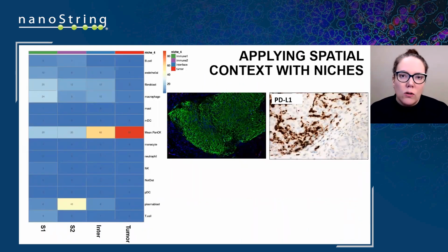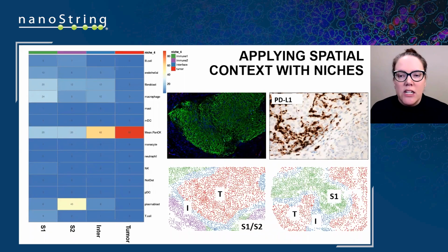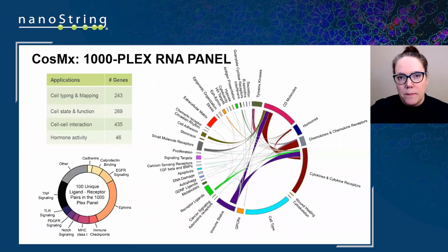So our next goal was to not leave it there, but to recognize that PD-L1 conventional immunohistochemistry, as shown on the right, is entirely spatially context dependent. It's not enough for the slide to be brown. You need to know what cells are expressing it in order to get a positive result. And so we designed spatial niches that replicate that clinical assay: tumor, interface, and then almost in a targetoid or radial array outward, stromal immune populations, where really it's the tumor and the interface that count, so to speak.